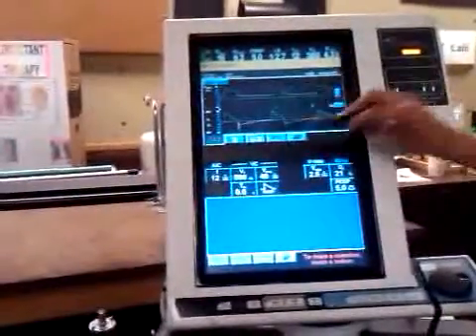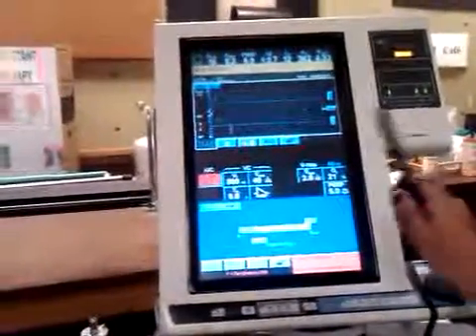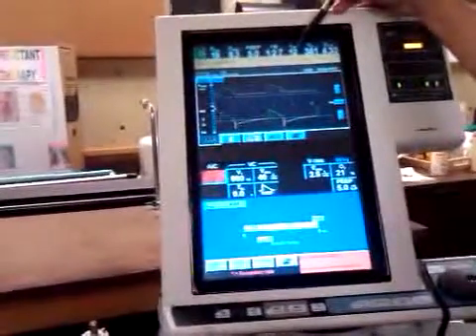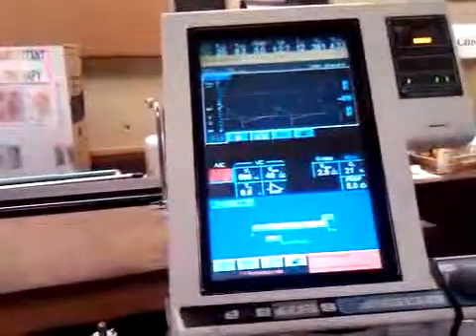So we are on assist control, and we want to get our P1 or P2. To get your P1 or your P2, you would have to get your minute volume, which is 4.34, divided by your frequency, which is 12. And that will give you a tidal volume.